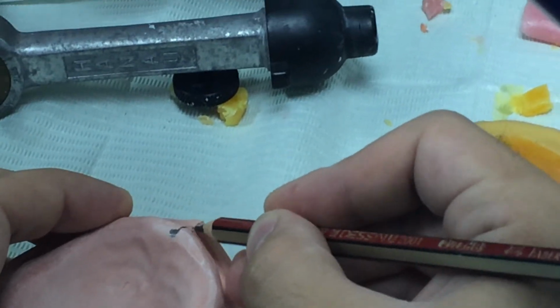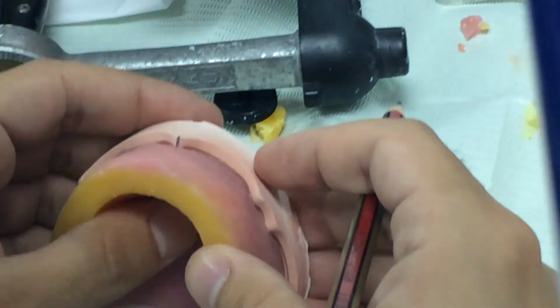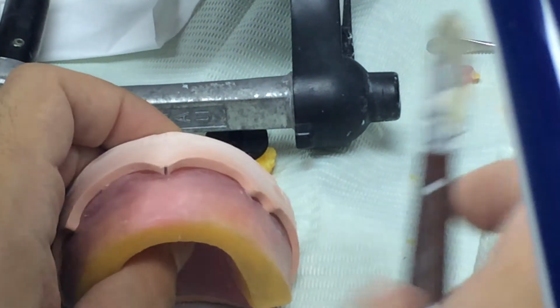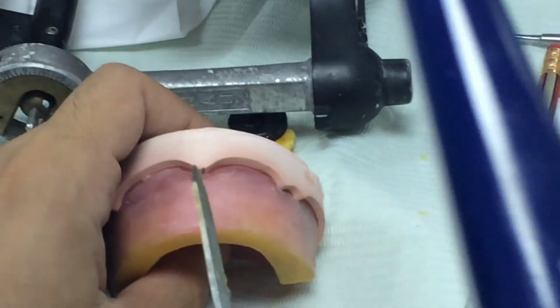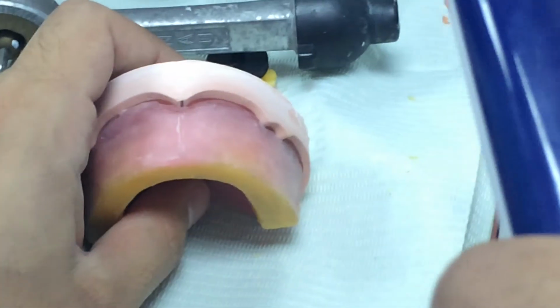Then you draw a line going out. It is almost the same for this case, but in other cases it is not. So then you have to make a mark like this to make sure this is your midline, and it should be the same on the mandible, going down to the mandibular.